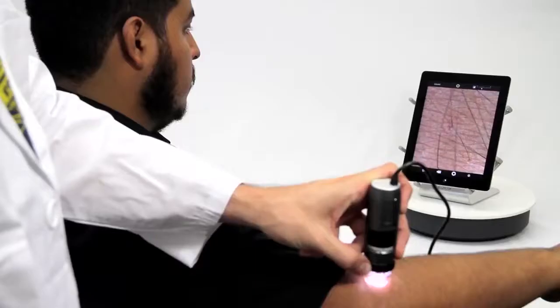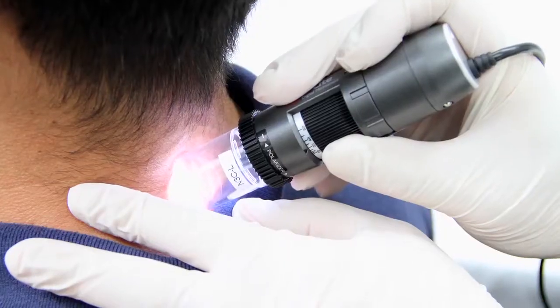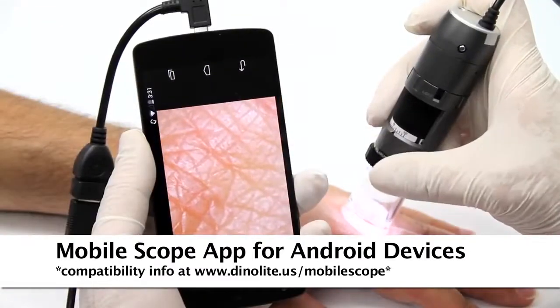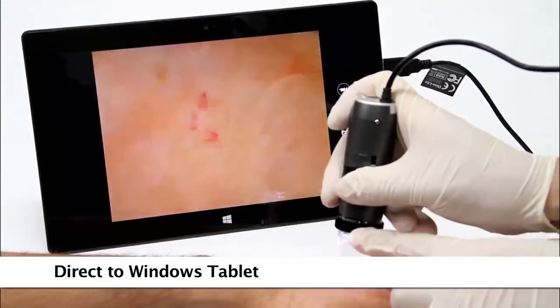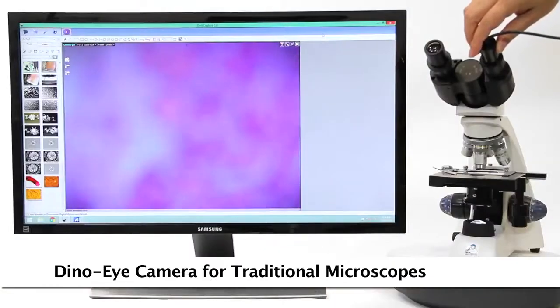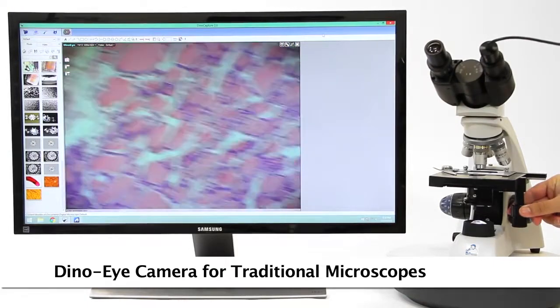There are also options for mobile viewing, including a Wi-Fi adapter and a direct connect option to compatible Android devices. You can also convert an existing traditional microscope to digital by replacing the eyepiece with a DynoEye eyepiece camera.